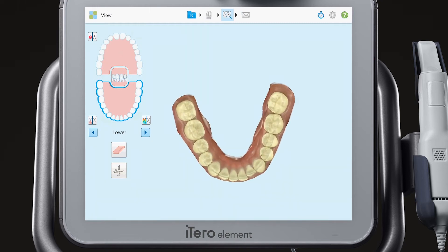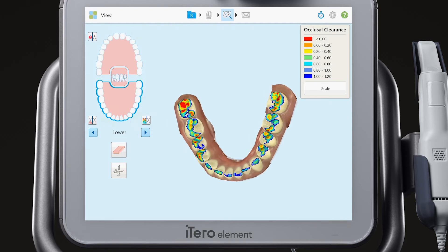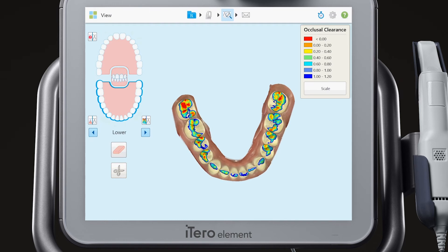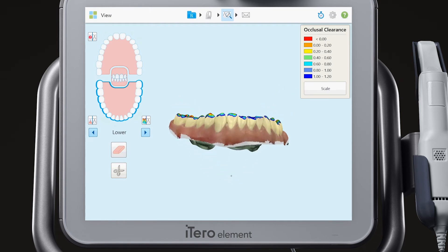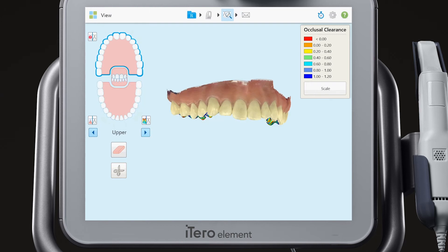Next, tap on the occlusal clearance button to view the arch in color, and review the occlusal clearance to evaluate the patient's bite. The occlusal clearance color map will show the contact relationship between the arches.